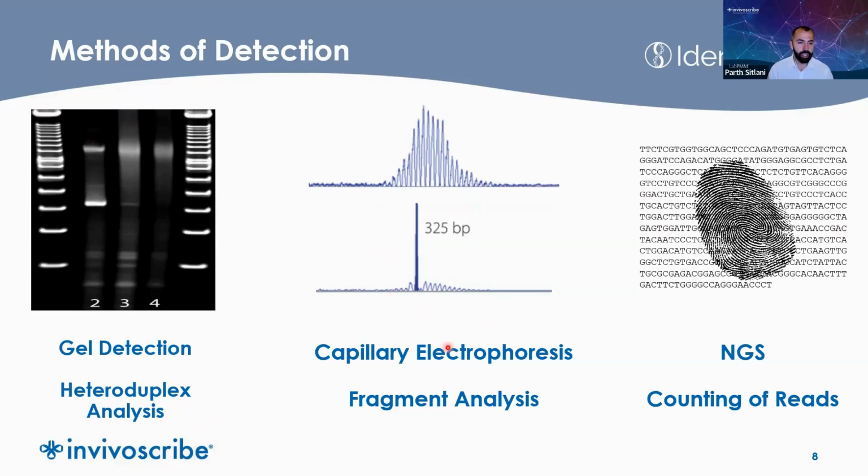Capillary electrophoresis uses fragment analysis. If you recall, I mentioned earlier that the length of each of those rearrangements is slightly different.